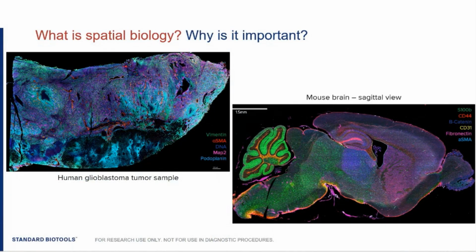what is spatial biology? Spatial biology is a field that focuses on understanding the spatial organization of cells within their native tissue environments. Unlike traditional methods that may dissociate tissues into single cells, like single-cell transcriptomic technologies, spatial biology preserves the context of where cells are located in relation to one another within a tissue. This approach allows for deeper comprehension of cellular behavior, interactions, and the microenvironment within complex tissues, such as tumors or normal tissue samples.